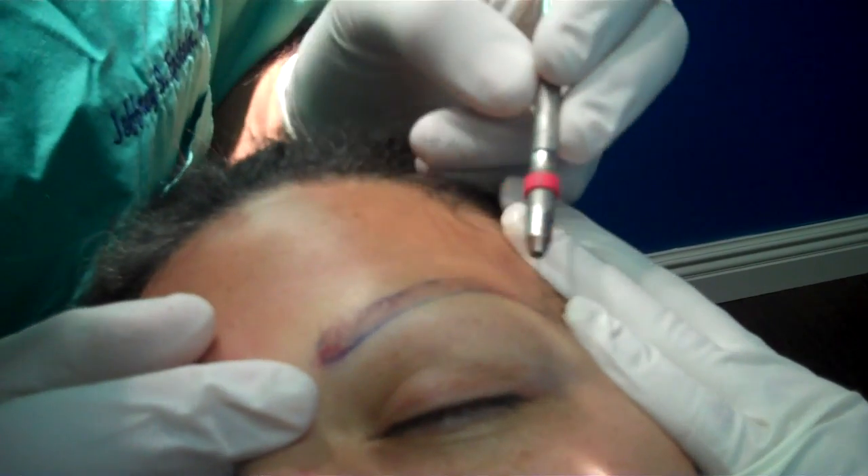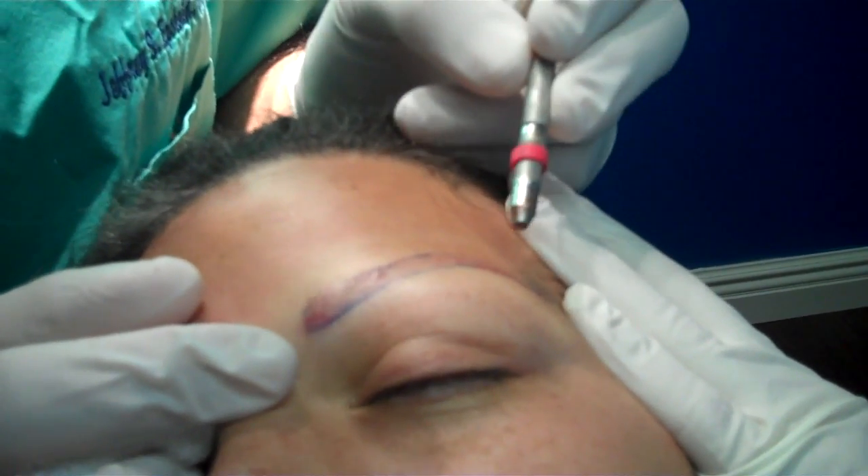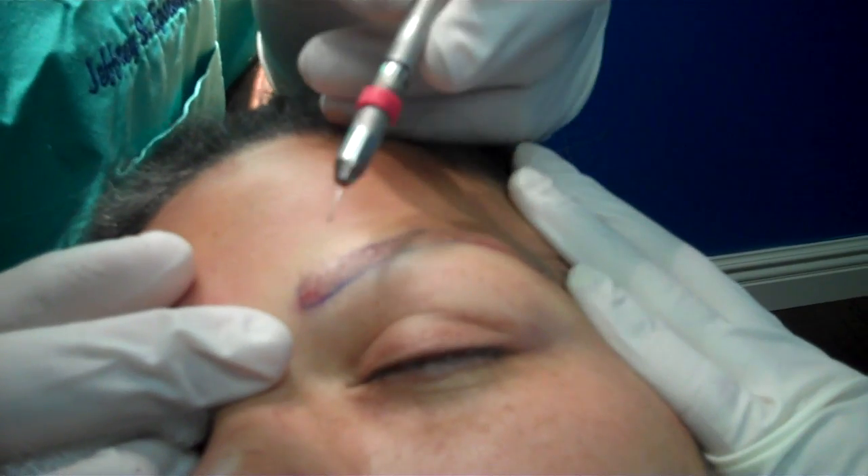Hi, this is Dr. Epstein. I'm here showing the making of an eyebrow, basically the restoring of an eyebrow with a transplant procedure.